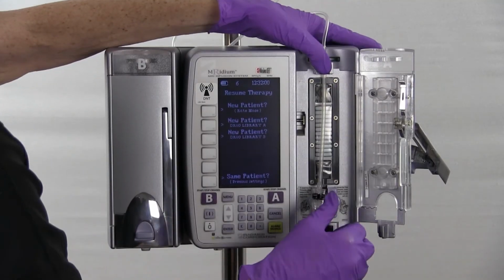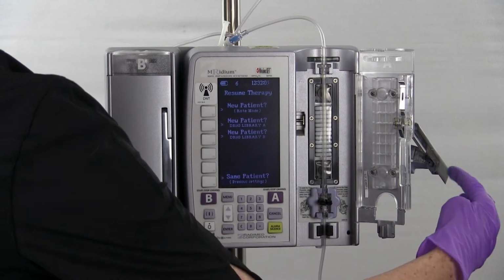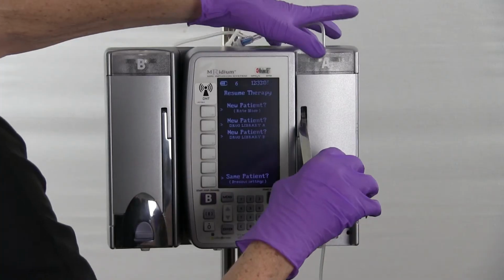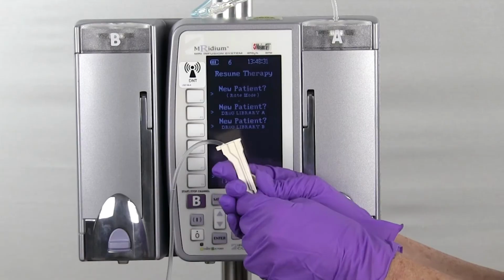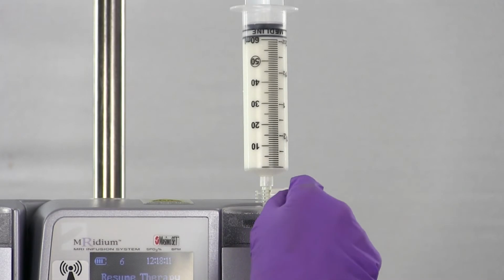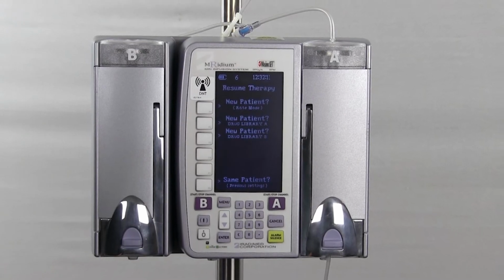As a best practice, it is recommended the user inspect the installation to assure the tubing is correctly loaded and properly aligned before they close the door and secure the latch. Be sure the latch is flush with the door to ensure the door is completely closed. Finally, the user will open any closed roller clamps, slide clamps, and air vent ports to verify there is no fluid flow. The user is now ready to program an infusion.